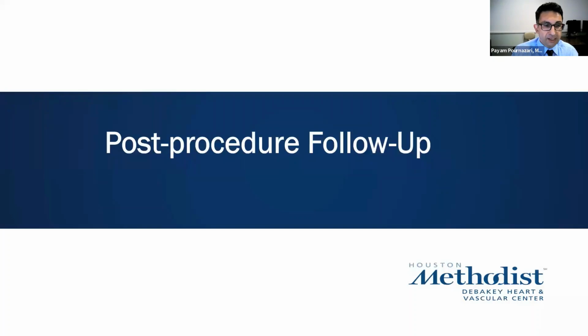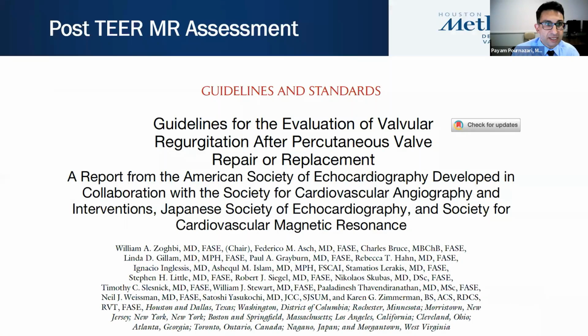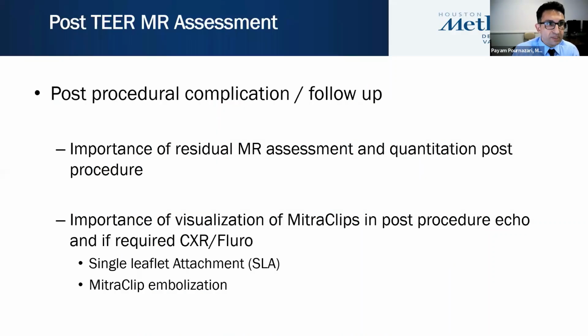For post-procedural follow-up, again, guidelines have a good table and clear recommendations. It is important to characterize and quantitate residual MR post-procedure. It is also important to visualize the mitral clips in post-procedure echocardiograms, and if required, get a chest X-ray or fluoroscopy.